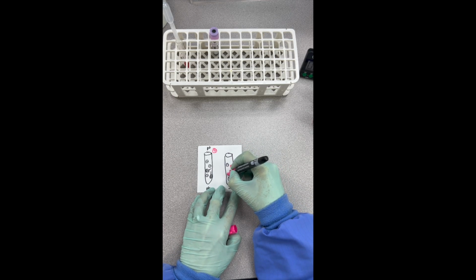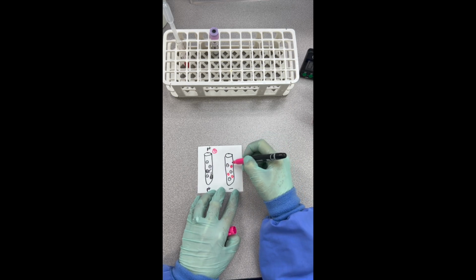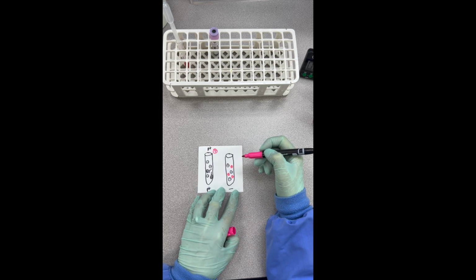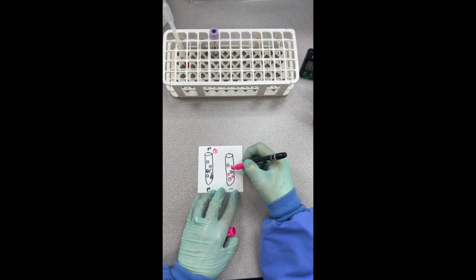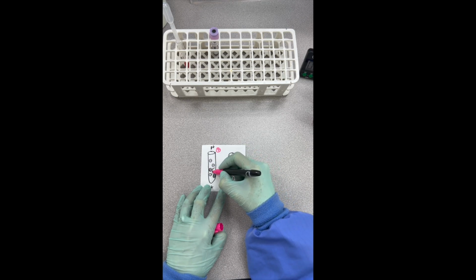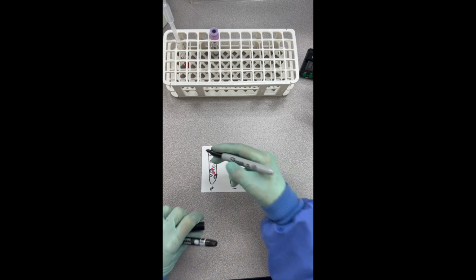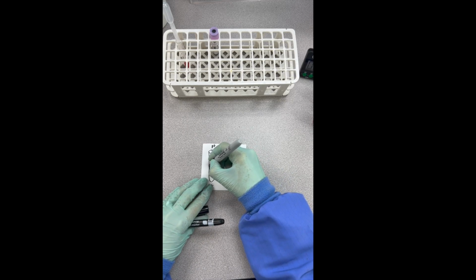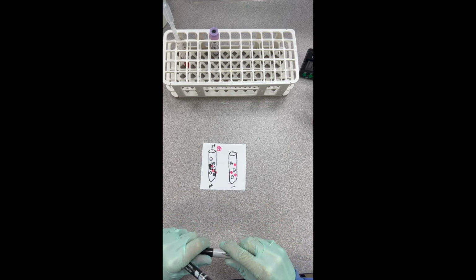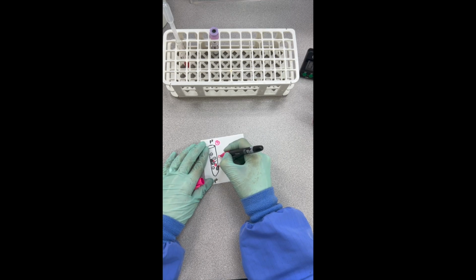in our negative control is essentially nothing. Okay, we're just going to have free-flowing Rh positive and Rh negative red blood cells floating around in there. But now our patient that had some originally Rh positive cells with some antibody on them, these indicator cells are now going to attach. Okay, and while they're attaching, now we're going to see clumps. And so that's why these are indicator cells. There's positive. Okay. So we're going to see clumps, or what we actually call them are rosettes.